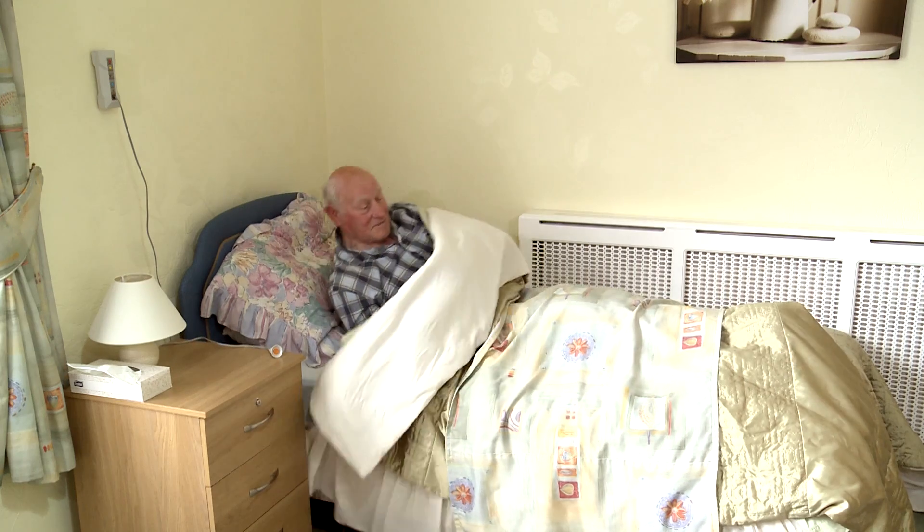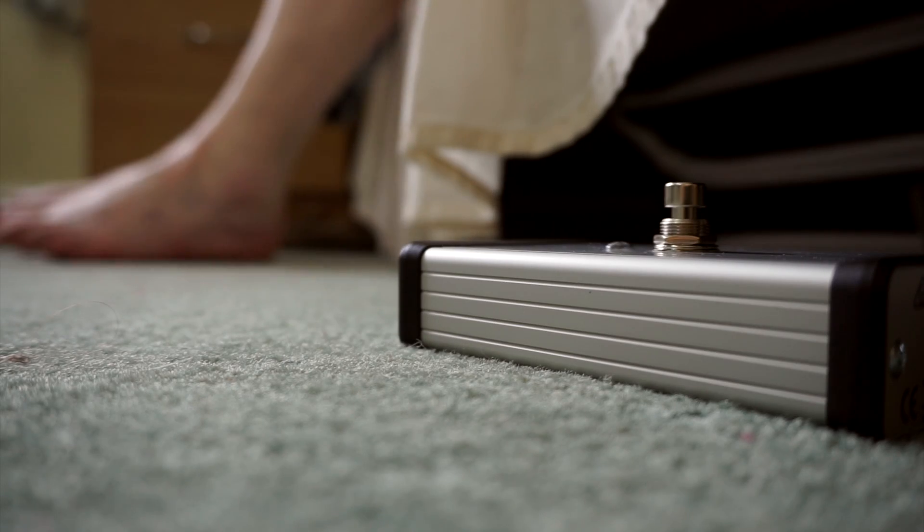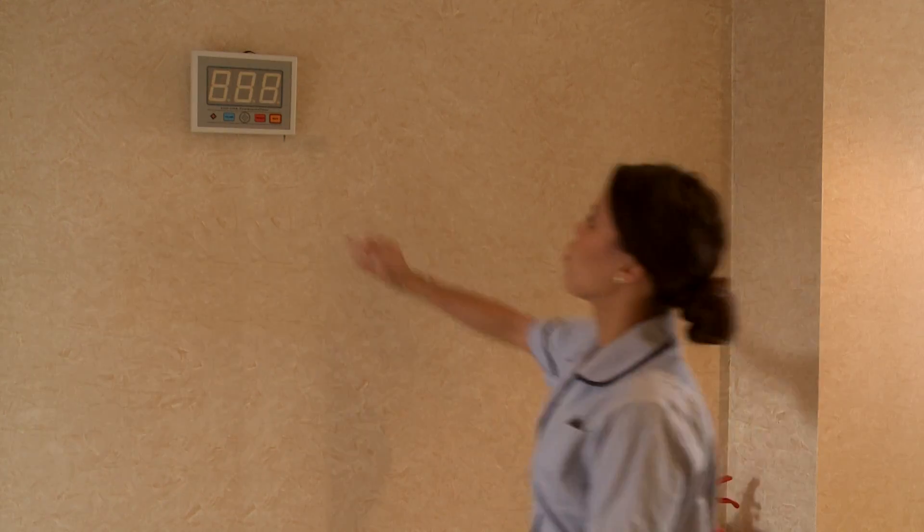We wanted it to be discreet. So what we've designed is something that's very small, can be hidden under the bed — the resident doesn't know it's there. Rather than them stepping onto a set area, our unit puts out a beam onto the floor, and as soon as that beam is broken it will activate the alarm.